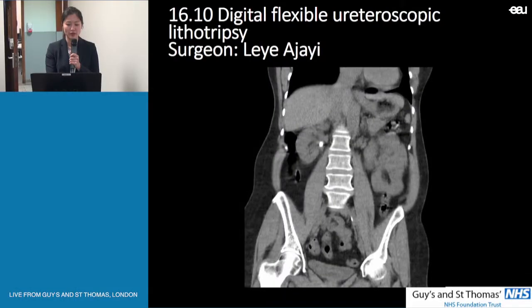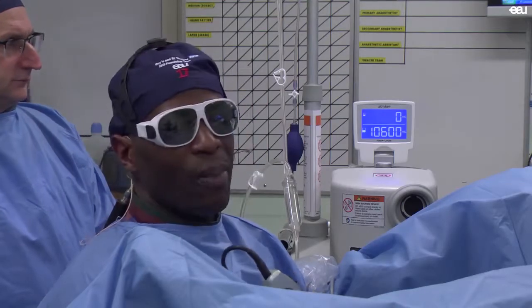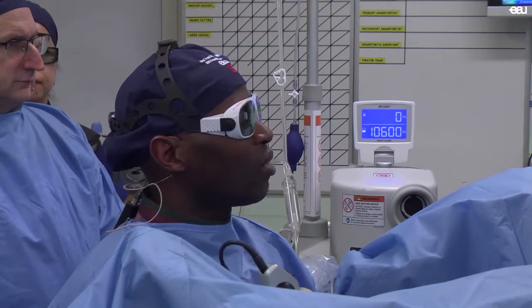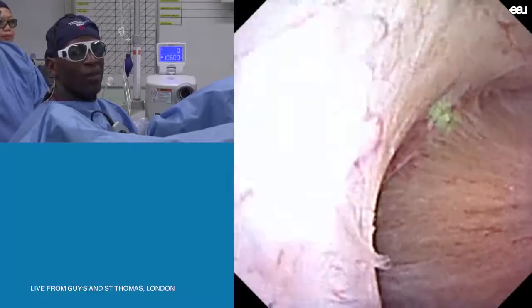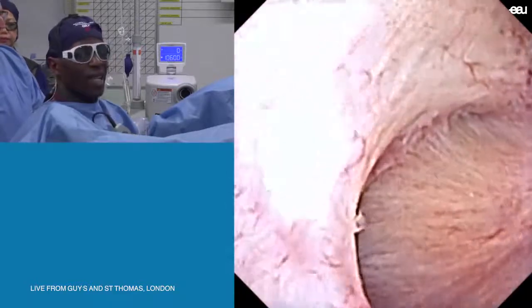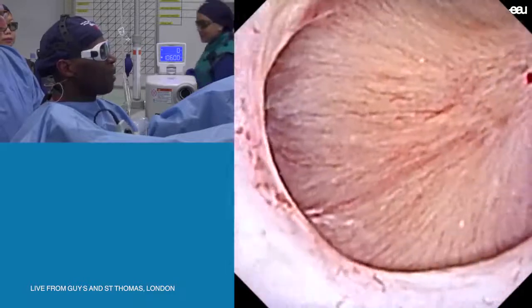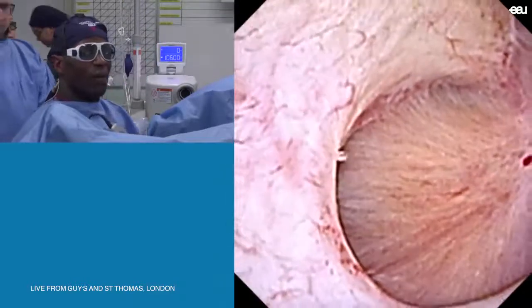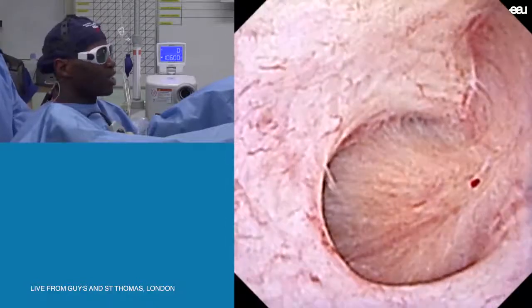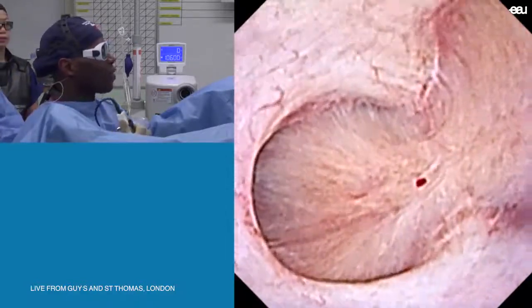I'll now pass you on to Mr. Ajahi. You've heard the history of the patient. We've now accessed the right renal pelvis. We've used an access sheath and we're using the digital Flex XC, the 8.5 French, which has allowed us straight access into this patient's kidney. As you can see, the view is excellent.